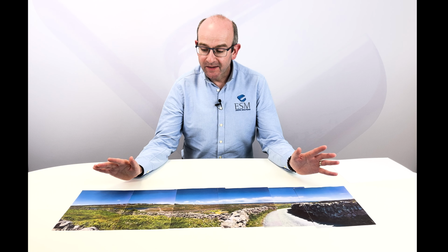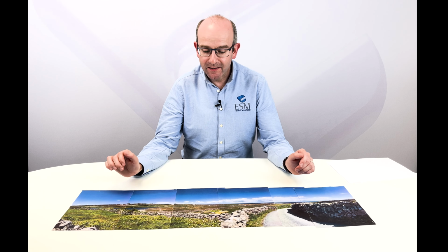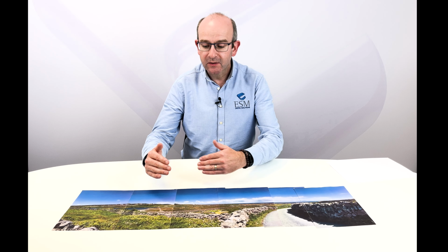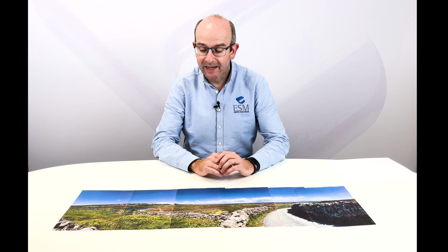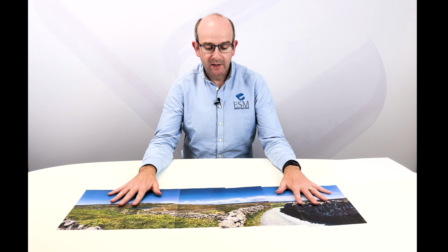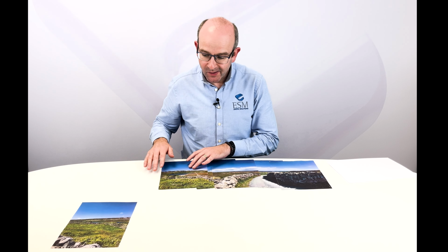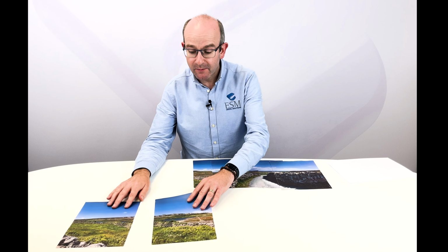So this is an old school panoramic photo. We've got 6 different photographs of a landscape, and we've printed them out, cut them out, and laid them out and aligned. I think it's a really good example to help us understand what's happening with an intraoral scanner. So we'll start off with the first image. We take an image, and then we capture another image, and then we try and stitch them together.